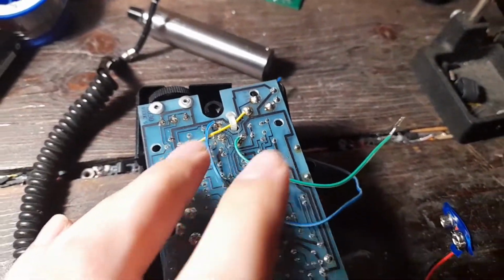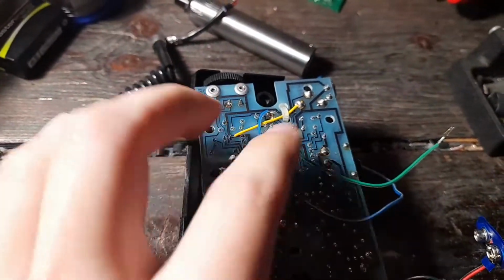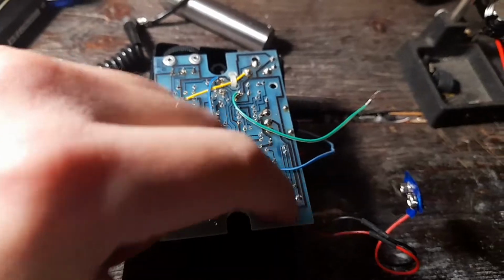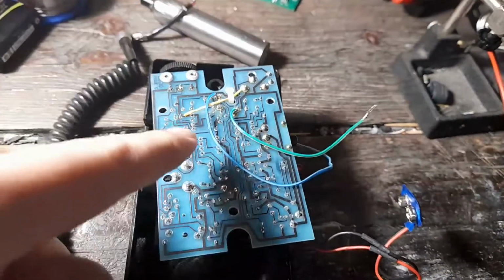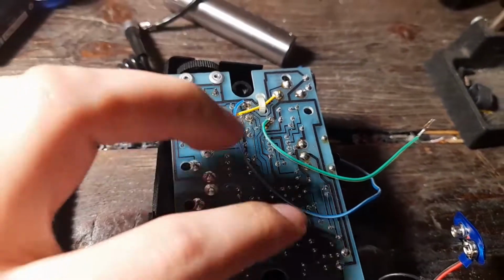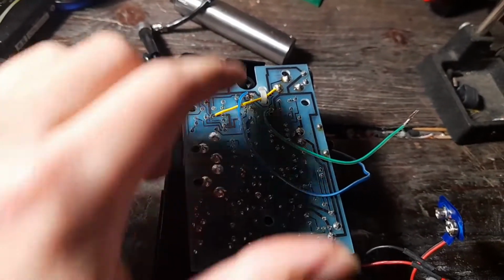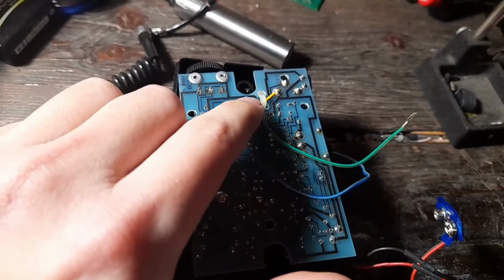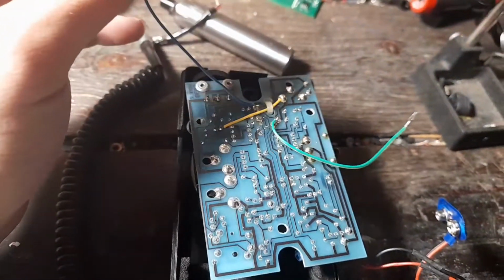Just measure using a multimeter the continuity to find the ground, and it's obvious that the ground starts from the battery terminal and traces all around the board. And I also measured approximately 9 volts on the other connection, so we are only left with the third signal, which is the actual audio signal trace.